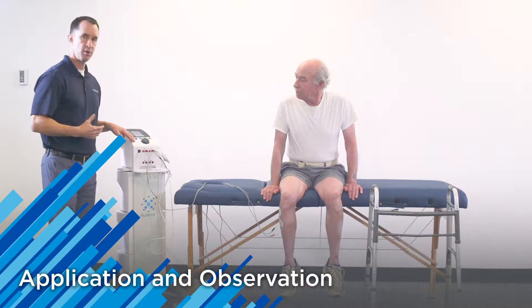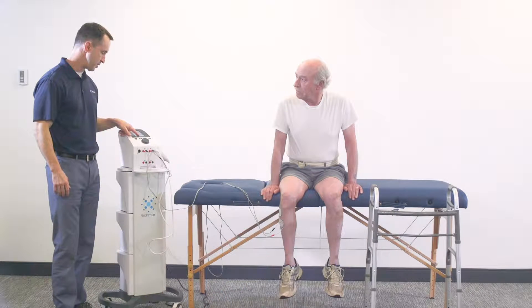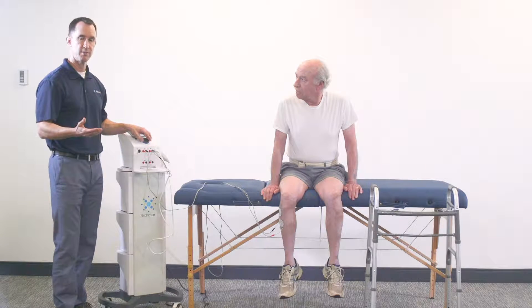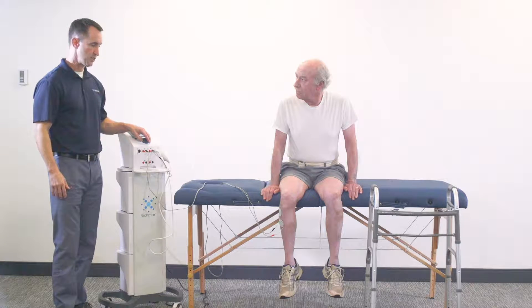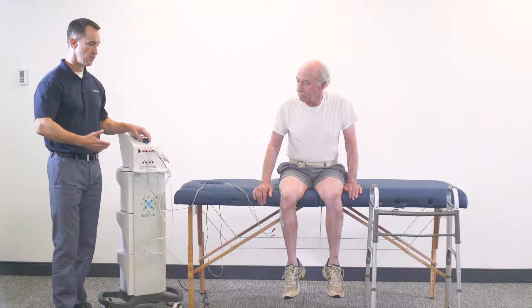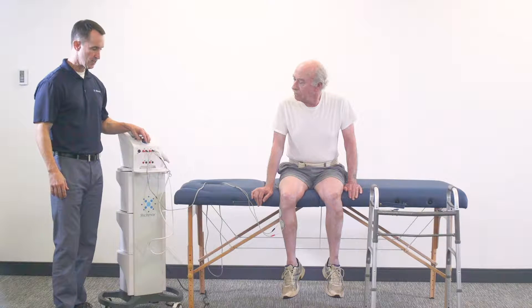I've got the NMS protocol already pulled up on the device. I'm simply going to select the amplitude button on the screen and increase the intensity. What we're looking for is a strong submaximal contraction to help facilitate ankle dorsiflexion. I'm going to ask the patient to let me know when he feels a tingling sensation, and then we'll continue until we see motor activity, a contraction, and dorsiflexion of the ankle.